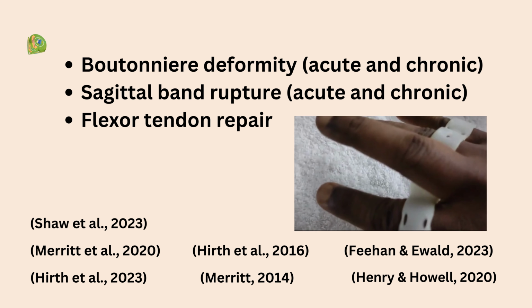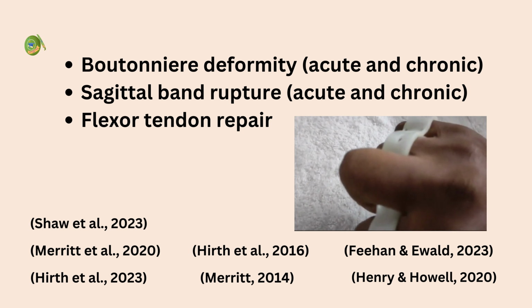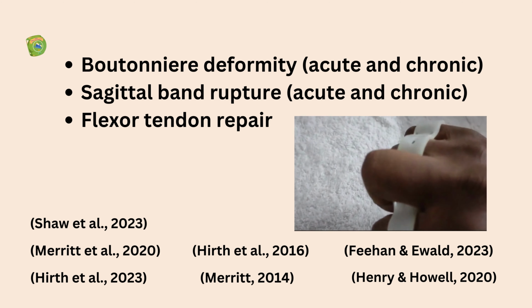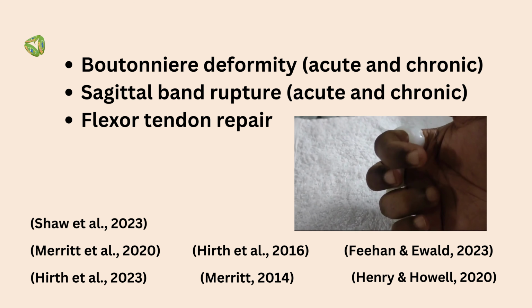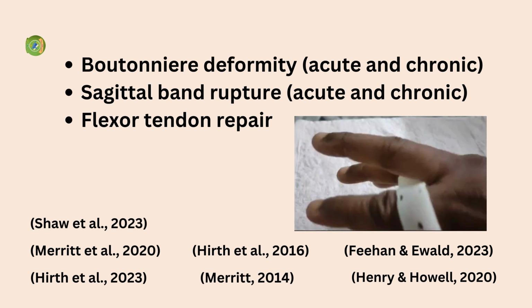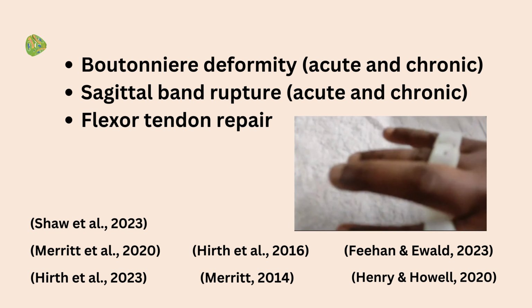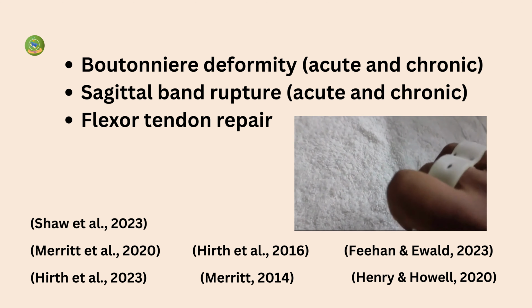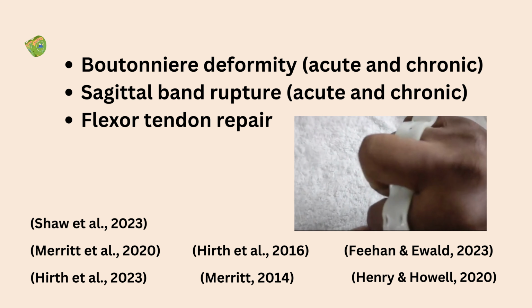According to Shaw et al., there is now good evidence that the relative motion approach is safe in zones 5 and 6 for extensor tendon repairs. Limited evidence currently exists for zones 4 and 7 extensor and for flexor tendon repairs. Variability in the use of a relative motion orthosis, such as only RMO or RMO plus, that is with its extension, use of sleep time resting orthosis, differences in orthotic wearing schedules, etc. pose difficulty in research, thus limiting the external validity.